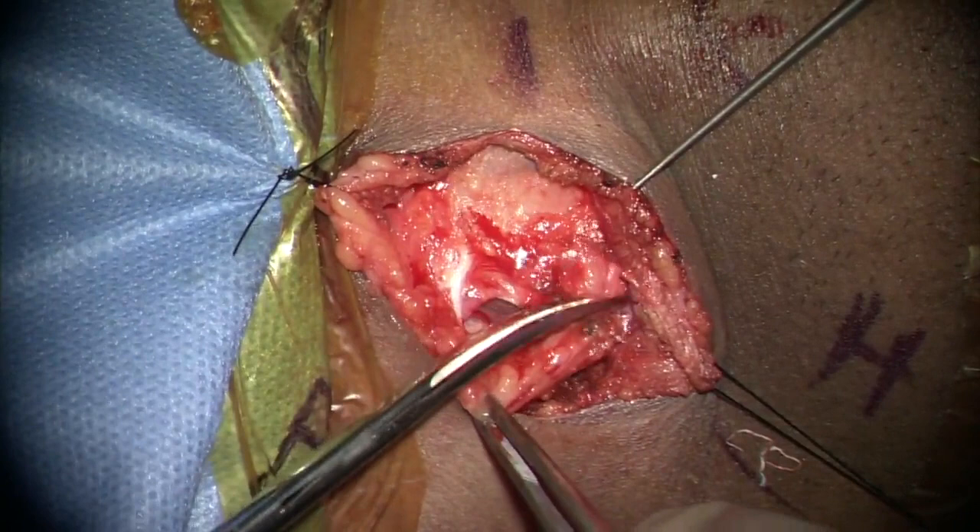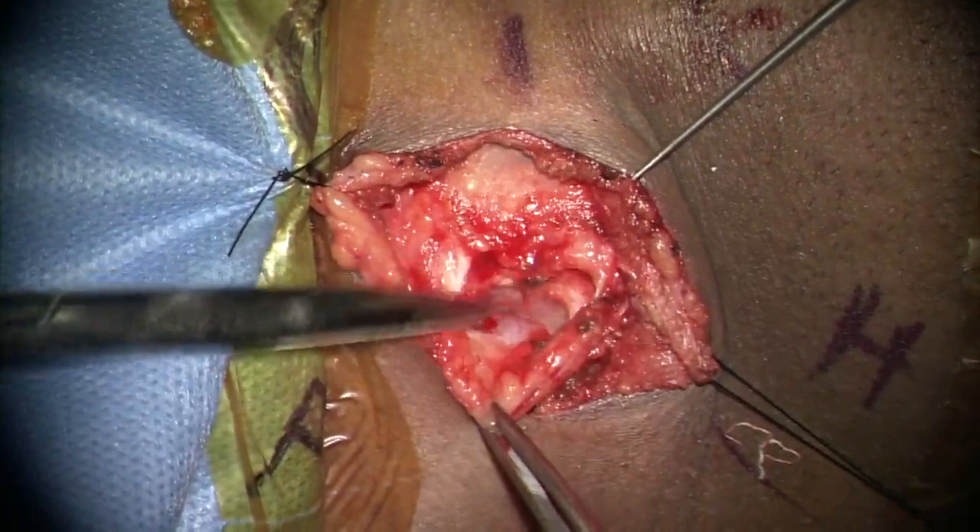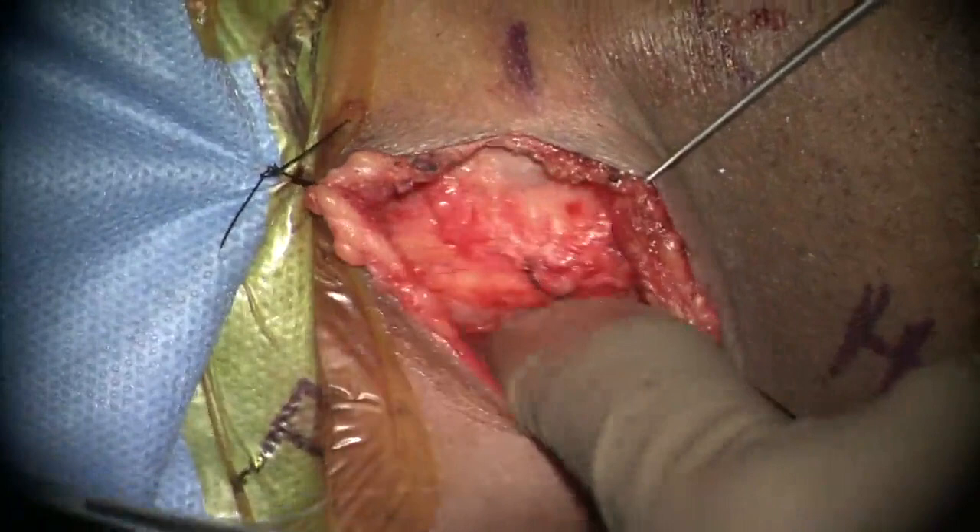The superior belly of the omohyoid muscle is usually encountered at C6 level and, to help with exposure, can be retracted medially with the trachea or can be divided.